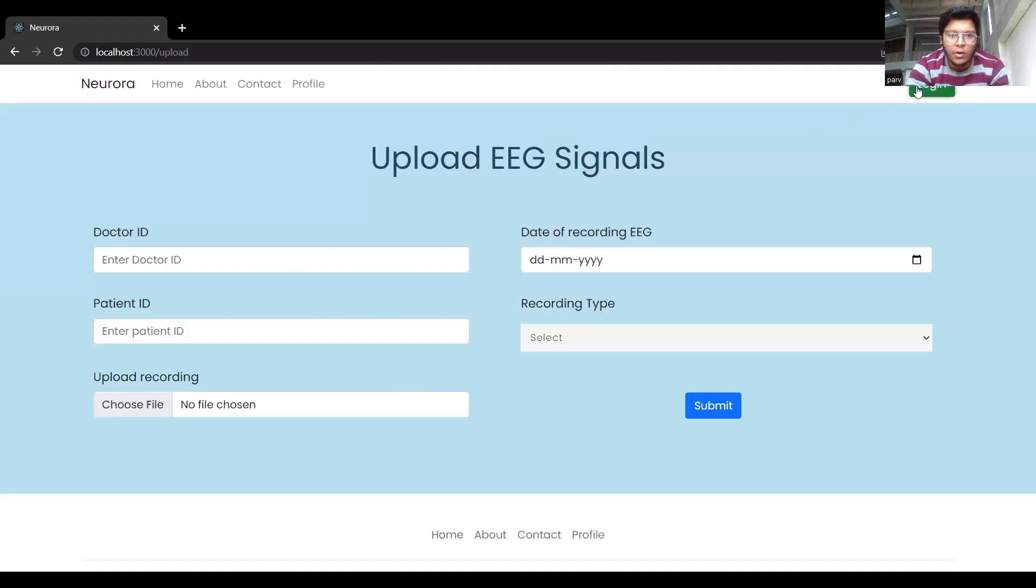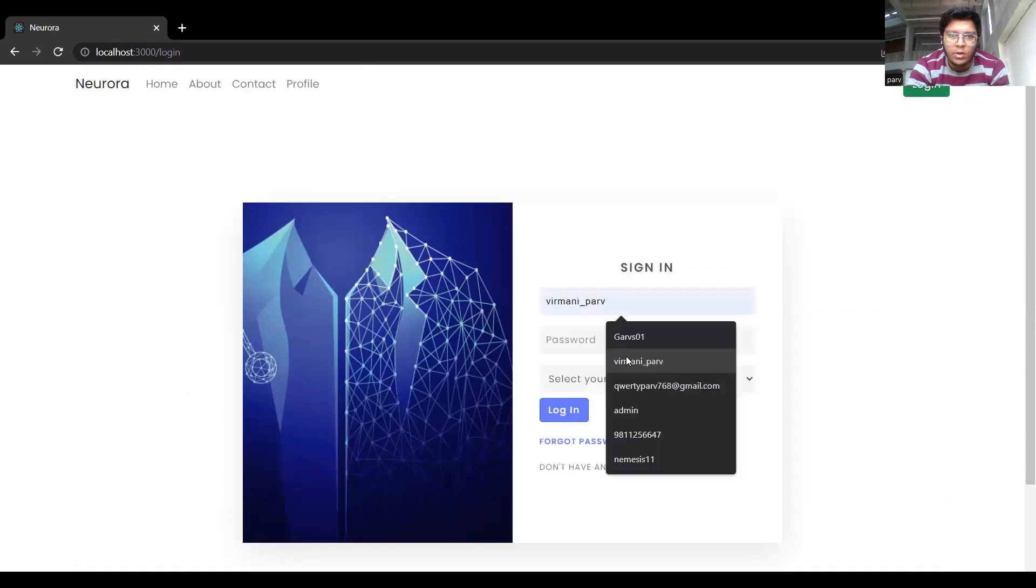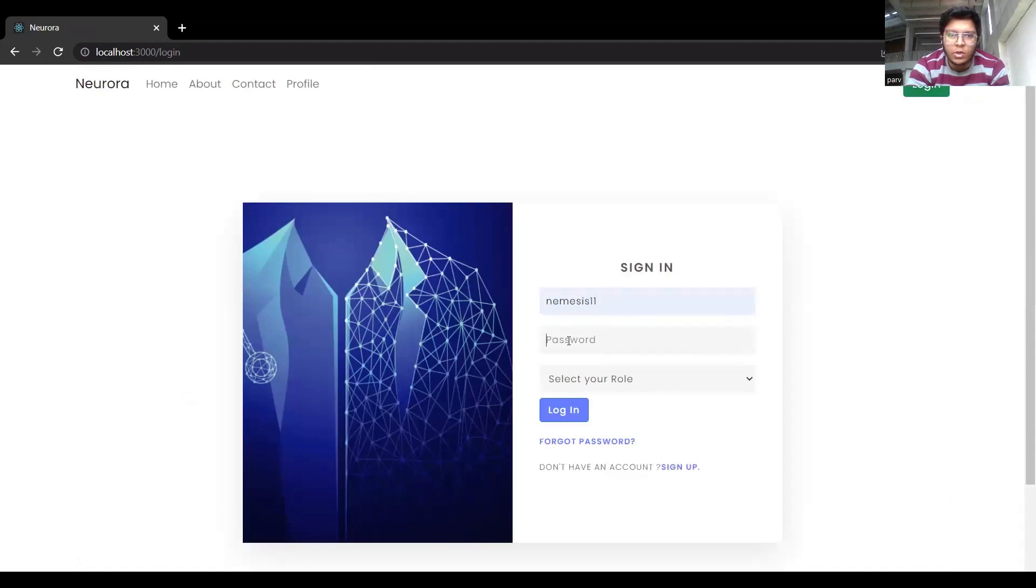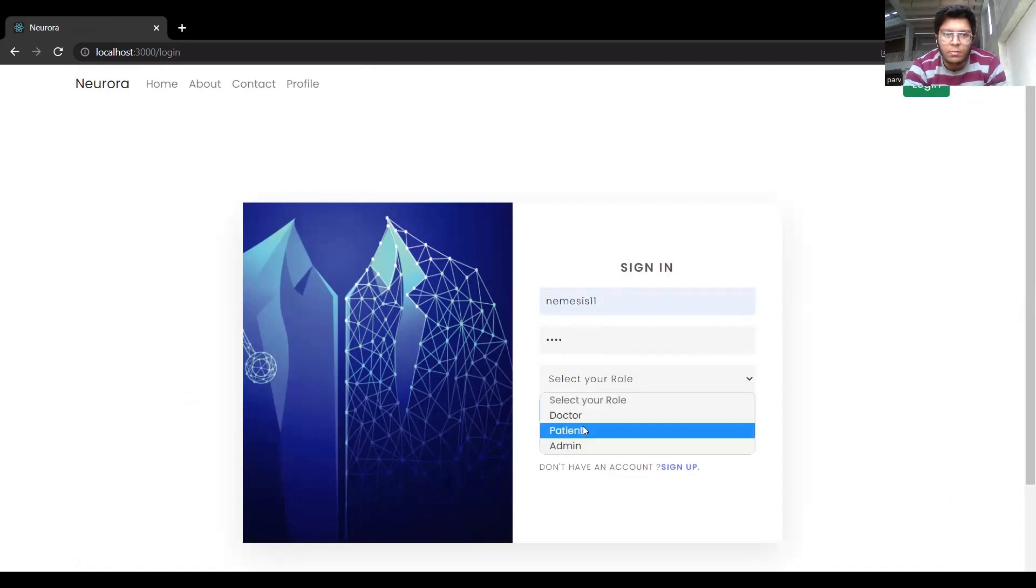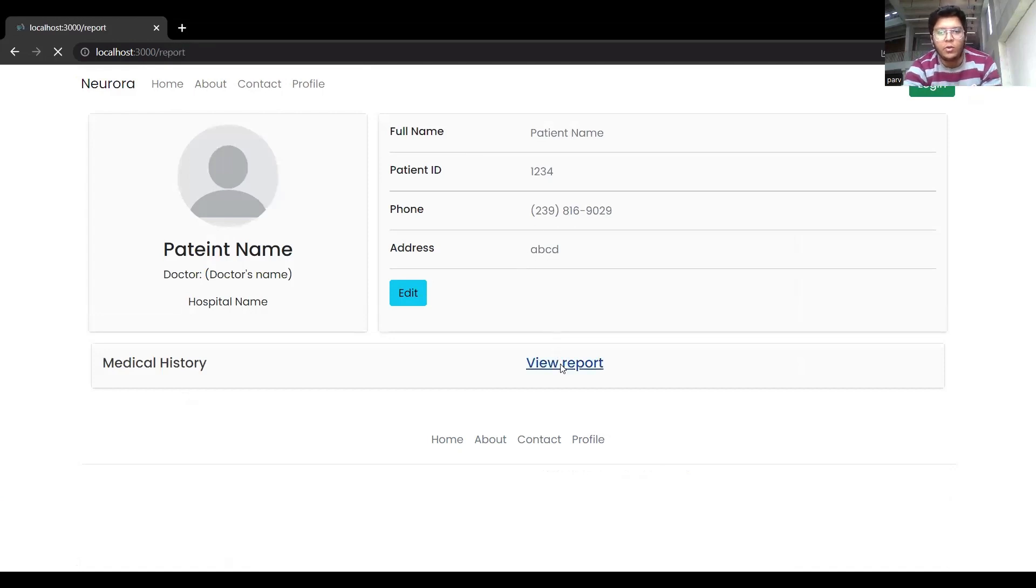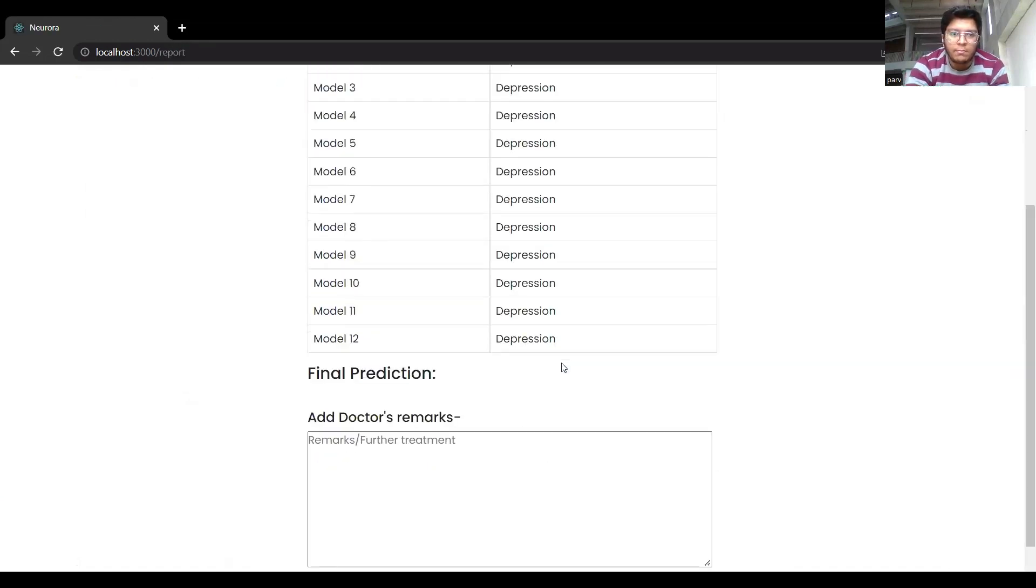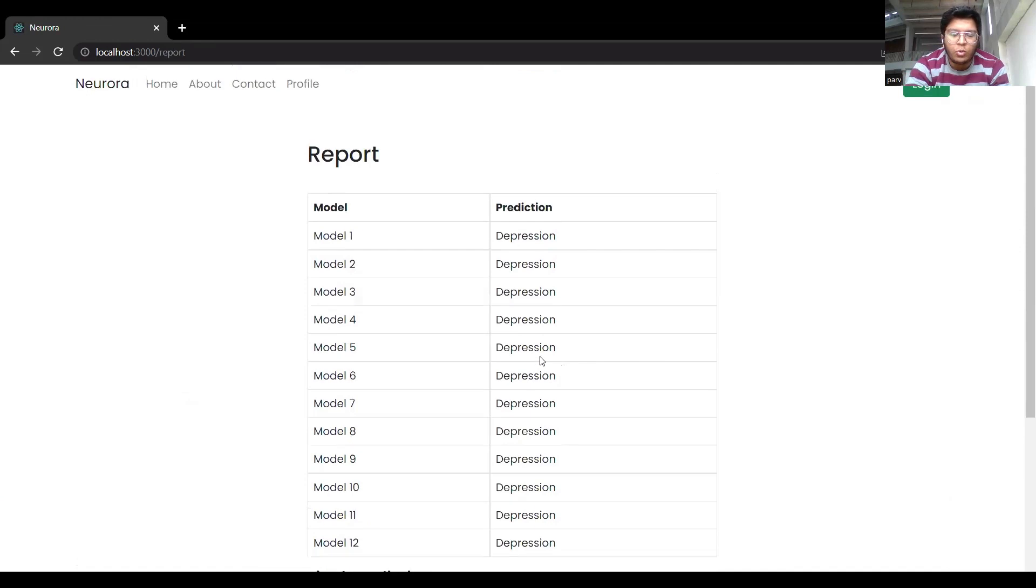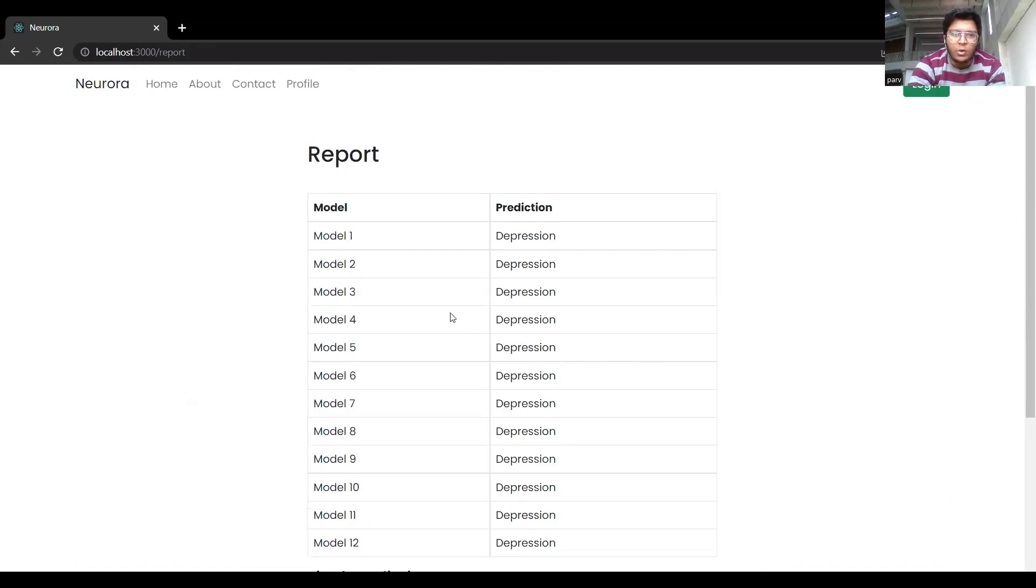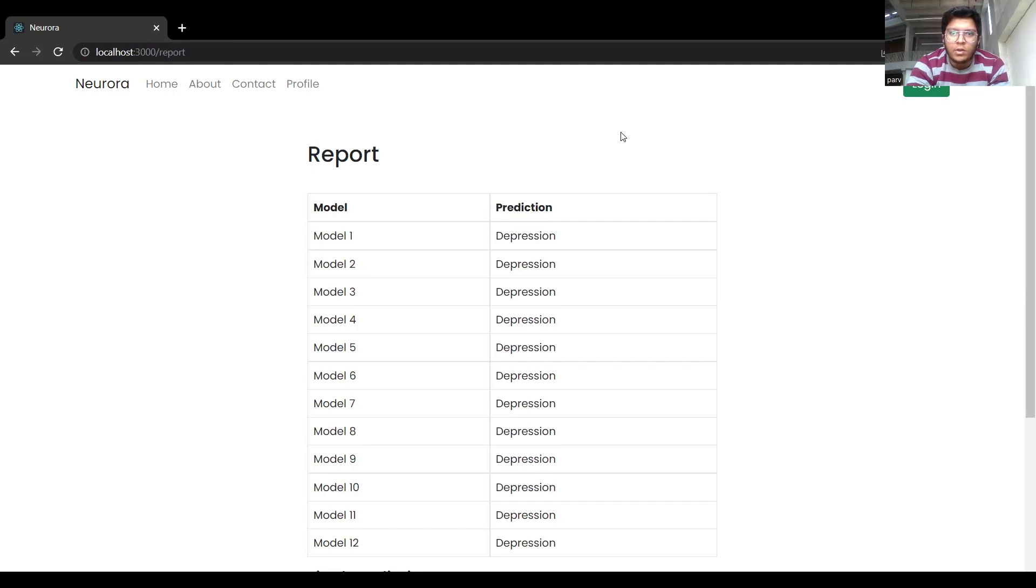So now if you want to log in as a user or the patient, you can see all the details of the patient also. You can also view the report. So now we would like to explain to you the underlying knowledge of these models that we have used, basic deep learning models. So I will stop my sharing here and let my friend Aksh share the screen.